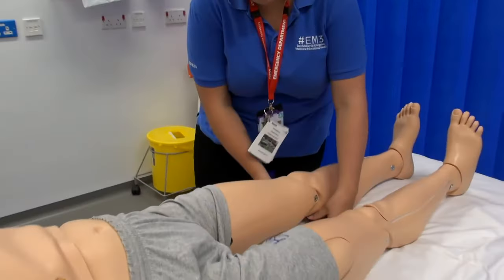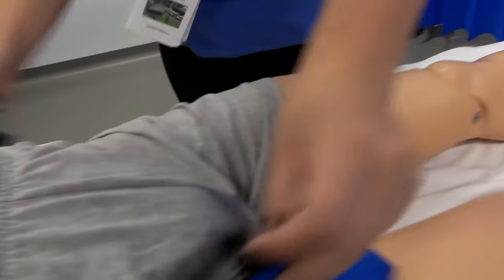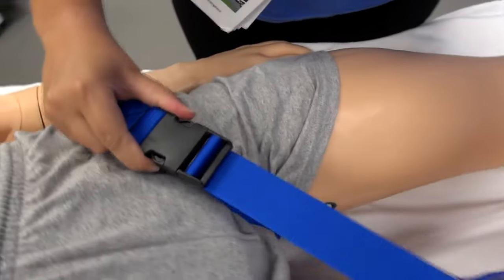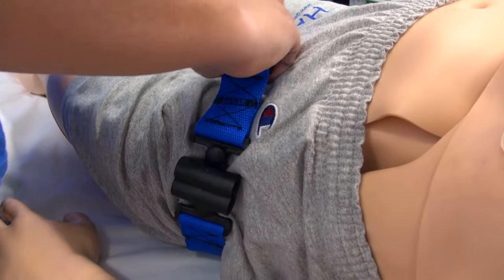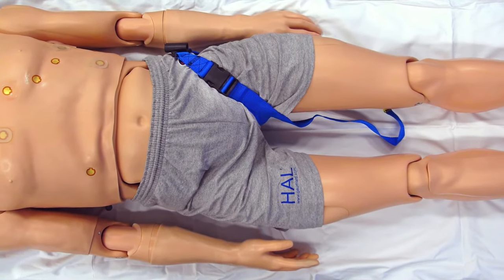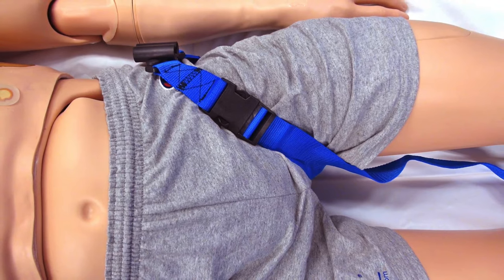The next part to go on is the thigh strap. Put it on under the patient's knee, slide it up, and tighten it, making sure the holes for the traction device are on the outside of the thigh. When the thigh strap is attached it should be at an angle in the groin so that the traction pole receptacle is over the belt line or the pelvic crest.